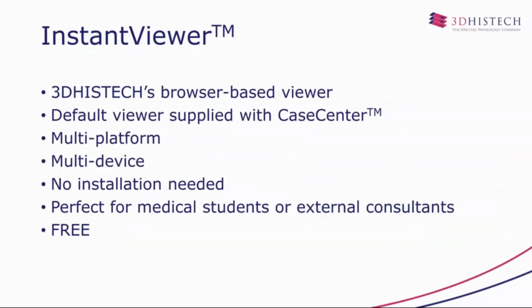In the previous slides, I showed you the highlights of our CaseViewer software. Now I would like to speak about other viewer solutions that we have.